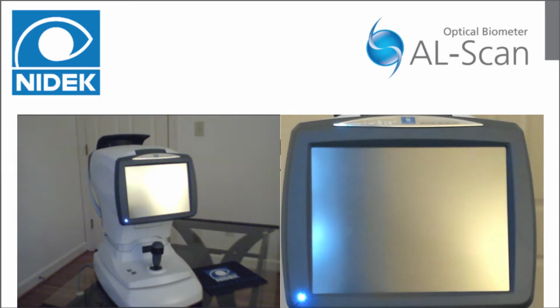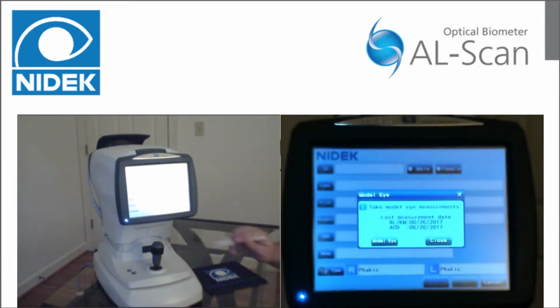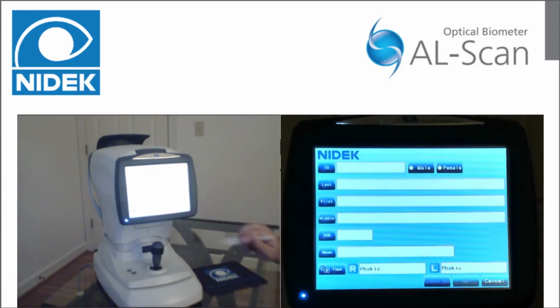The Model Eye window appears. Press the Close button or X button. Register any necessary IOLs to the AL scan, found in Chapter 2.2. Attach the shading plate to the headrest.